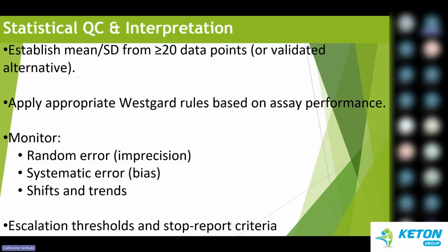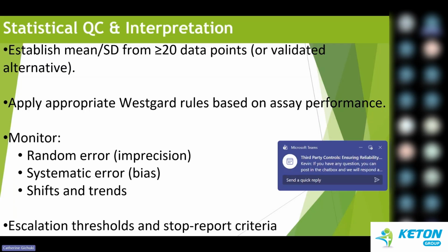Results will jump up and down unpredictably. That is a random error that shows imprecision. Sometimes you run a QC, it fails, you rerun, and it passes. Of course, that raises an alarm. So usually we cluster that as a random error.